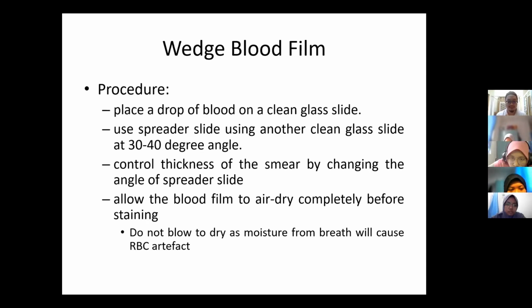So you'll be sharing, 4 of you per bench, and then you do the smear. Tapi nanti kalau dah habis, just wash and then dry and then you can use again. Okay. And then this drop of blood ni dia kita nak kecil je. Kecil tu macam mana nak cerita, that one memang subjective. Yeah, we have to do it in the lab. We see it, we know that is enough. Difficult for me nak kata berapa.